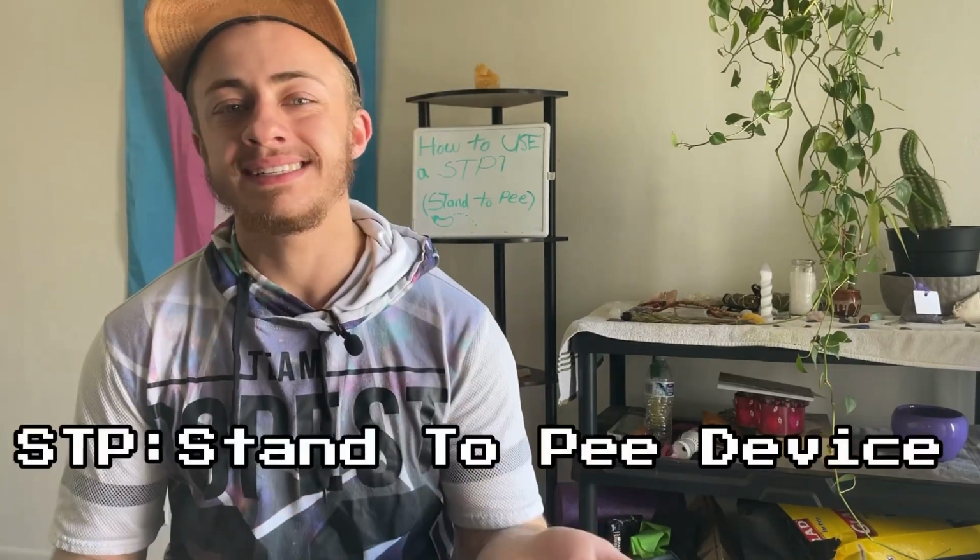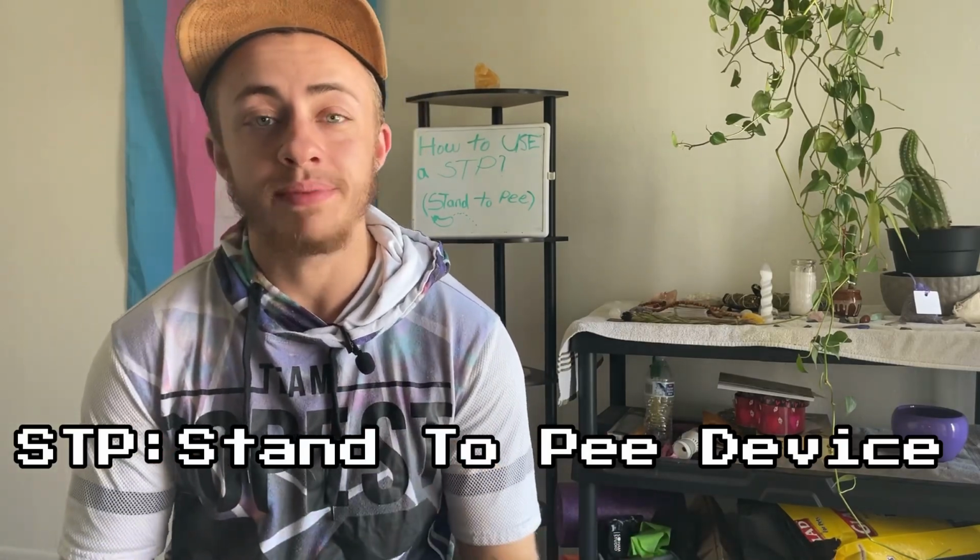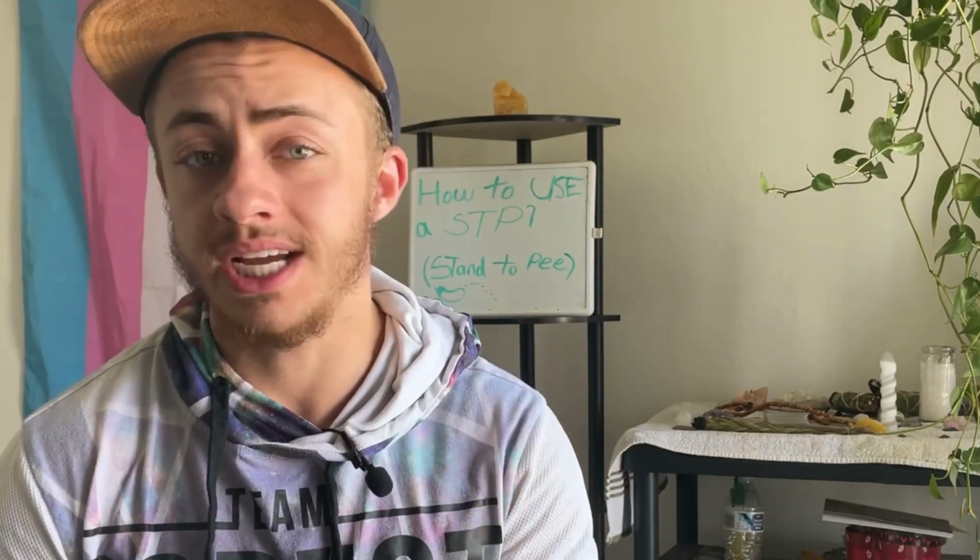An STP is a stand-to-pee device, usually in the shape of a penis. I've seen a few that are more just like a cone shape, but for the most part, they're shaped like penises. People that use an STP are usually trans-masculine individuals because using an STP and packing with it really does help relieve dysphoria. At least in my experience, it's helped me a lot. Especially at the beginning of my transition, being able to have the packer/STP in my pants and going to the men's room, walking up to a urinal or usually a stall for me, and just being able to actually stand and pee gives me so much gender euphoria and makes me feel so much more comfortable in my body.